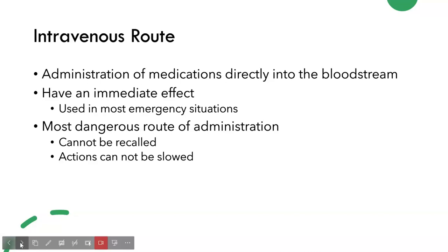And also with IV medications, some complications that could happen is that there is an increased risk for infection. So since we are giving something directly into the bloodstream, we don't want to introduce any microorganisms, any bacteria, anything like that. So that's why it's very, very important that we maintain aseptic technique, and we're going to talk about how to do that when giving IV medications.